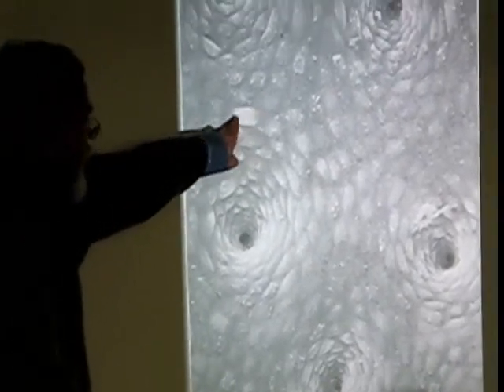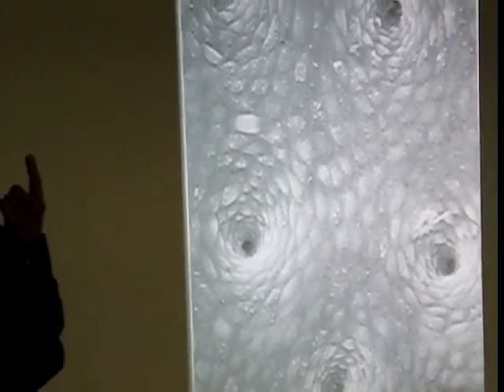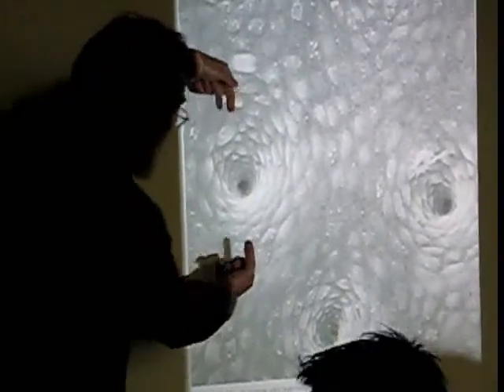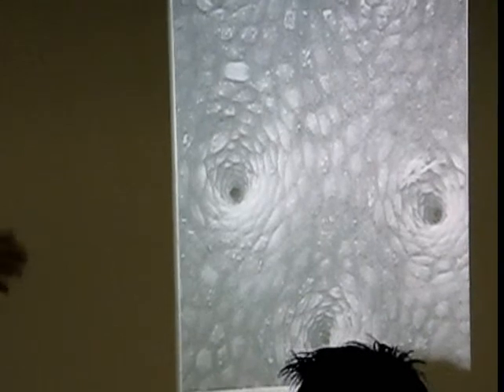This circular profile is the apical surface of a simple columnar epithelial cell that we call a surface mucus cell. All right? These cells are arranged like that as you go down into the gastric pit, which I want to remind you is probably best thought of as what? What is the gastric pit? It's a duct to the gastric gland. Okay?